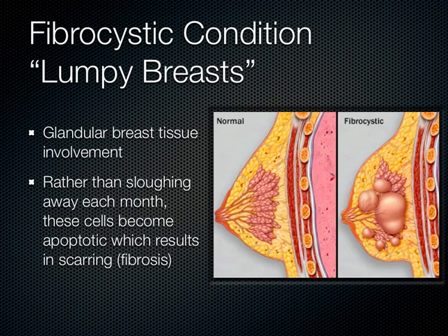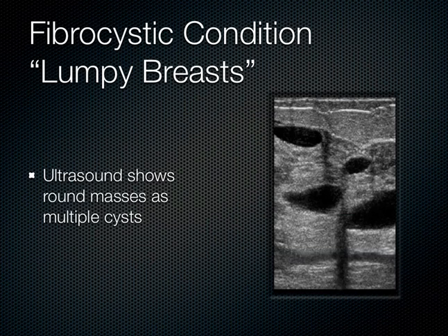And on ultrasound, this is what it looks like, just multiple cysts everywhere. And you can notice on the edges of these cysts, there's these shadows that come down. And there's another one here. And basically, that's something called refraction artifact.